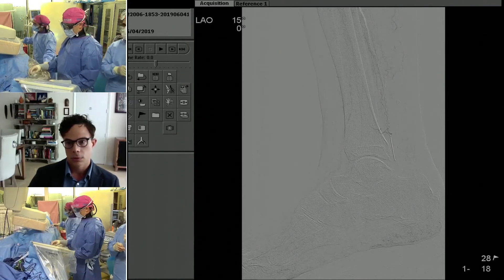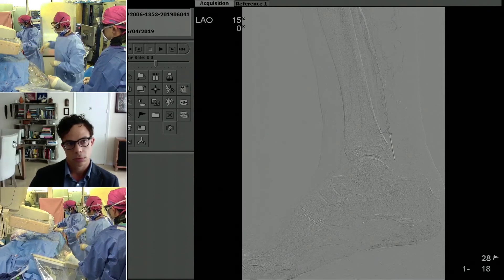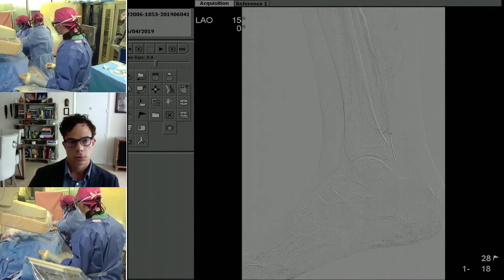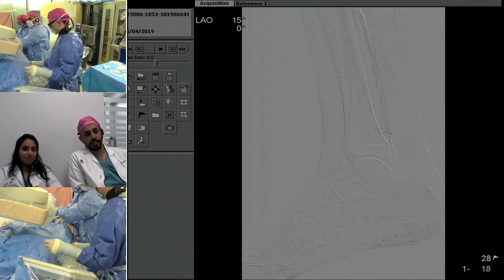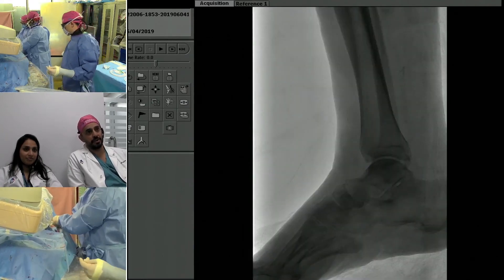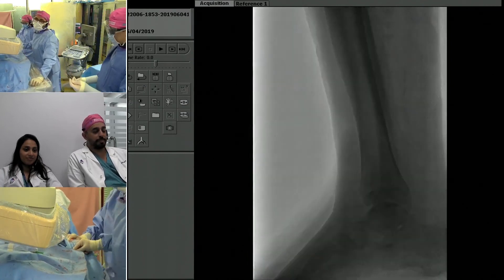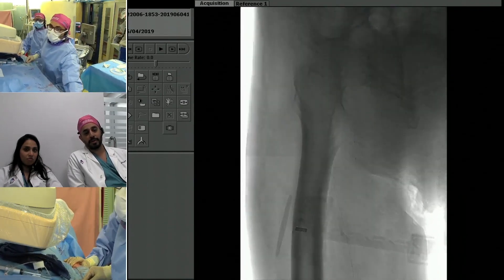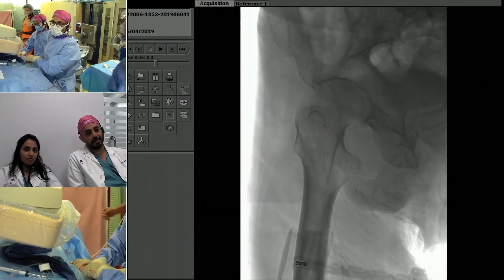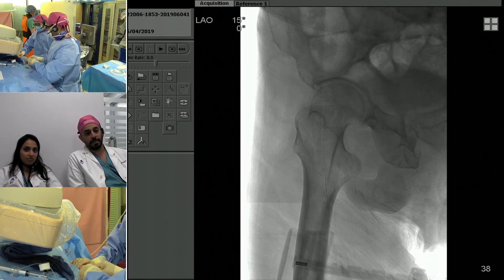We're going to swap out the 119 sheath for our short sheath and then use a TR band. To your point — this is a CKD patient and we want to limit contrast. He's going to get one contrast load for the angio, so we're trying to limit the amount of contrast at that point. We tried non-contrast MRA for a while and it didn't really work that well — it works for the pelvis and maybe the SFA in bigger patients, but anything popliteal and under, we weren't having good luck with it.